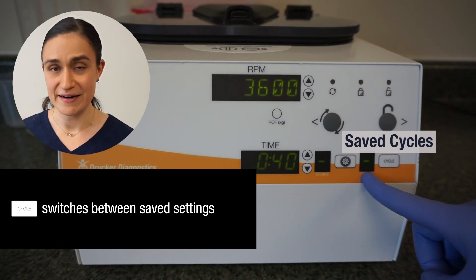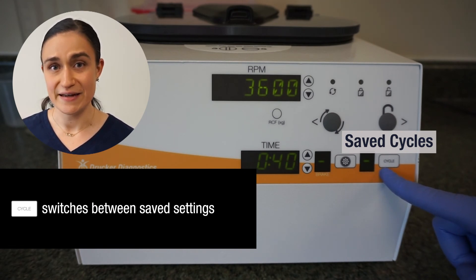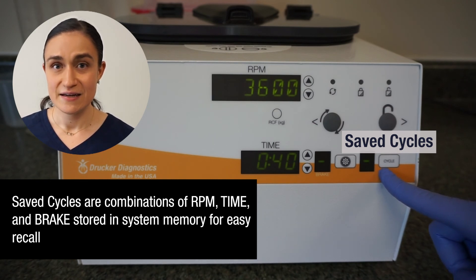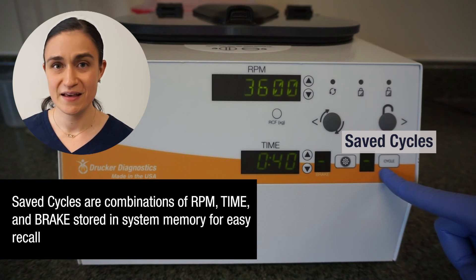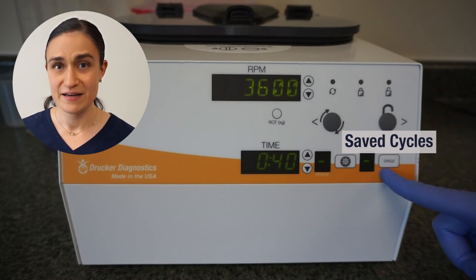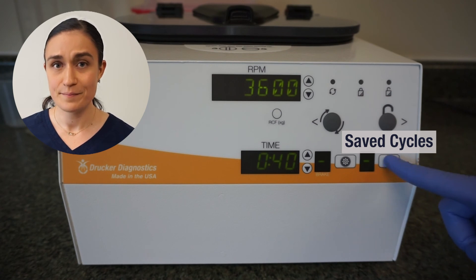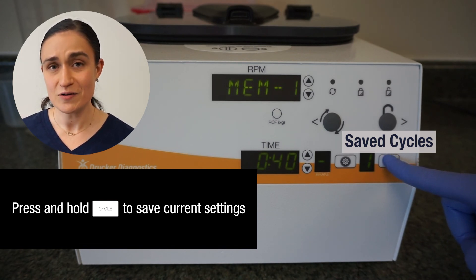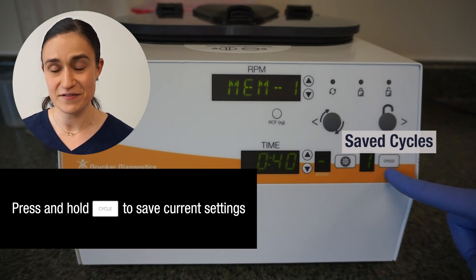Then we have the cycle button and the cycle indicator. The cycle button is used to create and manage your saved cycles. A saved cycle is a preset RPM or G-Force, time, and brake setting that has been saved to your SARA-12 memory for easy recall. Your SARA-12 can hold up to 10 of these preset settings at one time. The cycle button allows you to create a new cycle by pressing and holding it after setting your RPM, time, and brake settings accordingly.